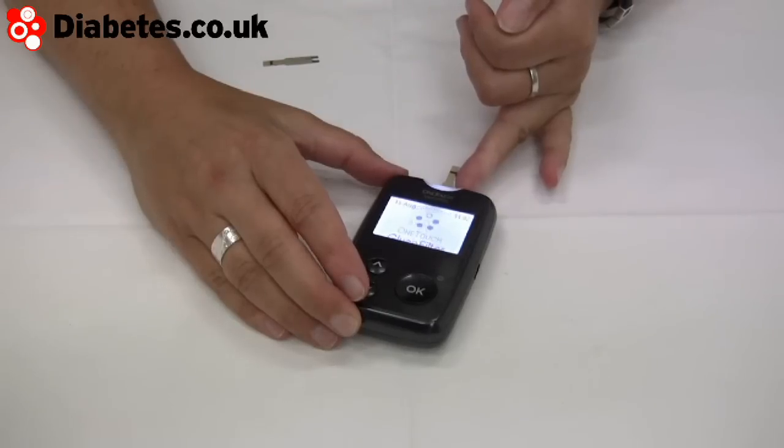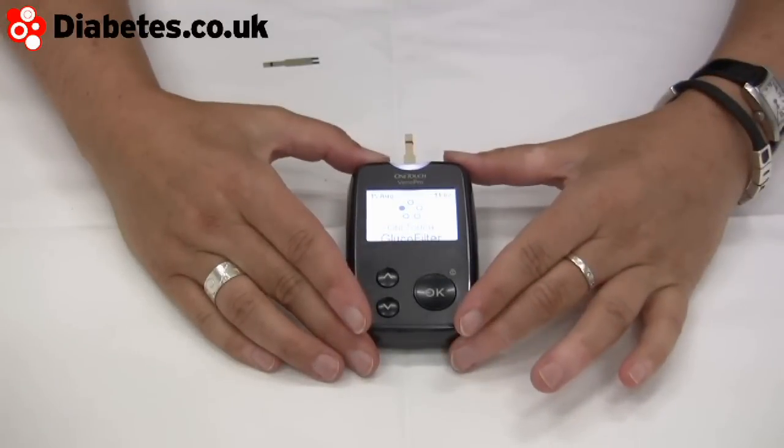The channel on this goes left to right. Most people expect to put their blood on the top, but this one goes from the side — you feed it in from the side, it sucks through, and it counts down.